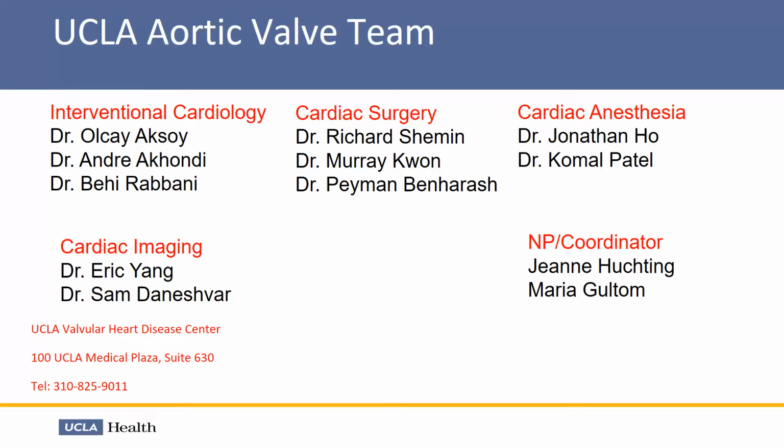Then you have to look at the CT. If somebody has high coronaries, I can say, you know what, I'm going to put the valve high because I'm not going to obstruct anything when I come back to do a valve-in-valve. Or you can say, these coronaries are a little bit low, borderline, so I need to put the valve a bit lower. I'll accept the risk of putting a pacer in now, as opposed to having to do surgery when the patient is 85 years old. So it's a bit of a moving target, unfortunately. It's always an ongoing struggle and debate that we discuss in the morning.